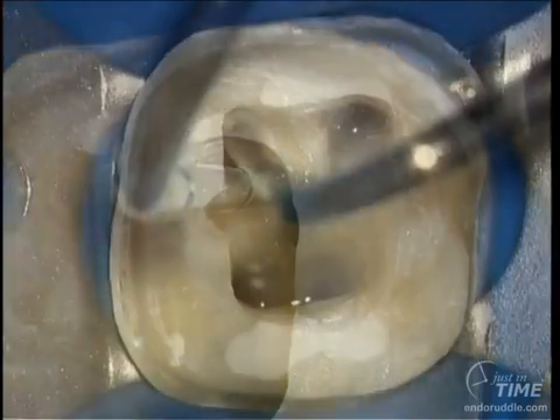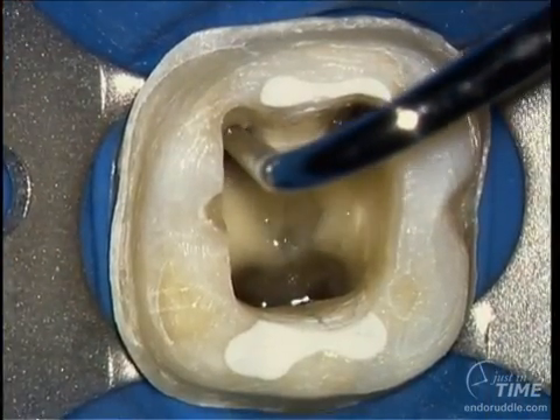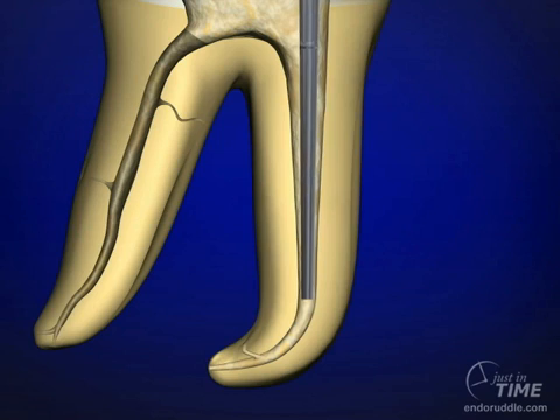The pluggers have convenient lines at 5, 10, 15, and 20 millimeter intervals, so we always know where we are. We can further be oriented by placing a rubber stop on the plugger if so desired.